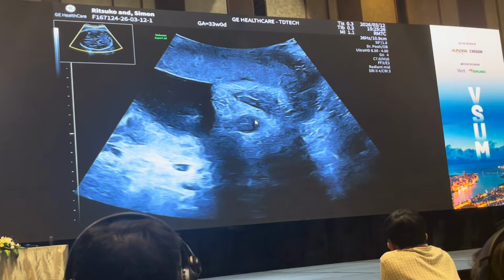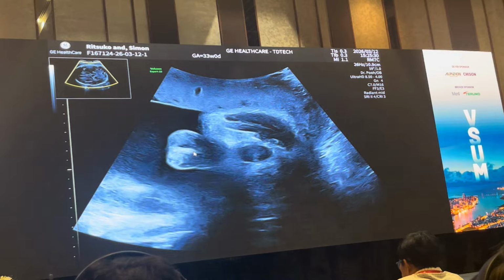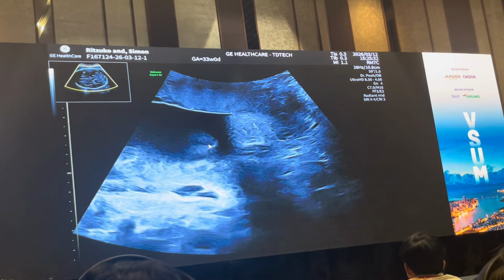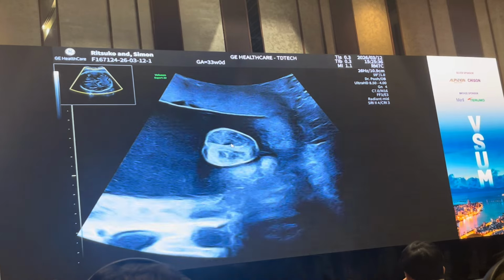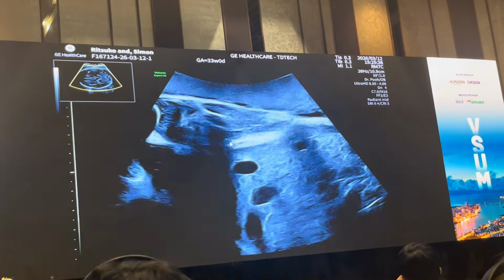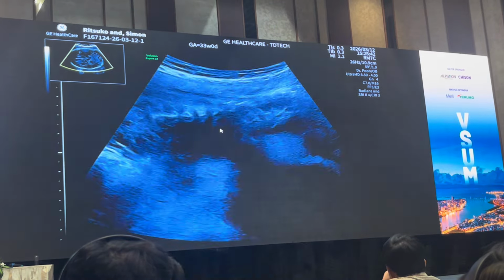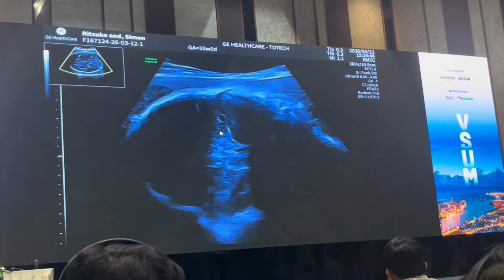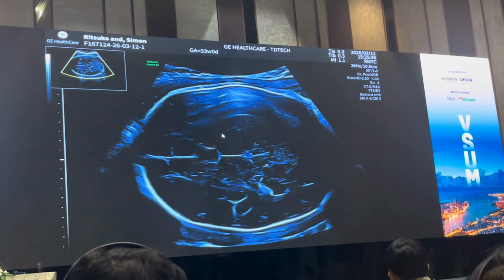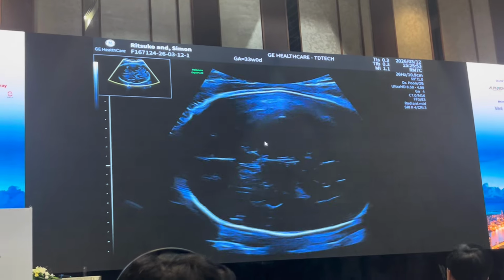And we come up to the anus, the anal sphincter, the target sign, and then onto the genitalia. The genitalia are always important when it comes to ventriculomegaly. So that's the single sweep, and then I go from left to right. And I can conclude there is a single live baby in cephalic presentation at 33 weeks of gestation.